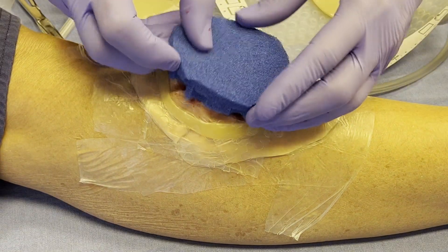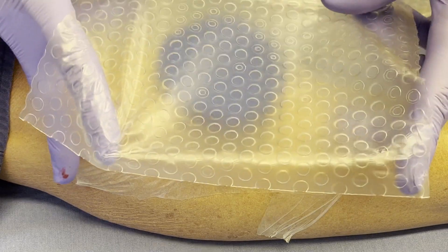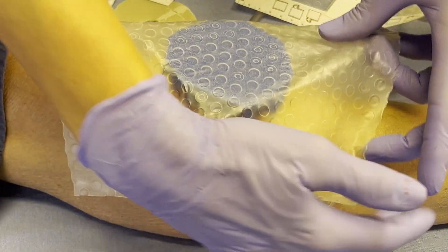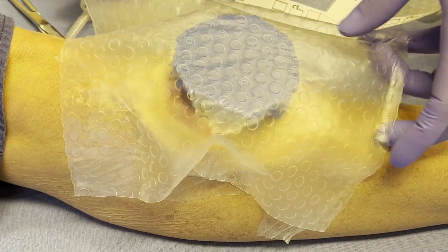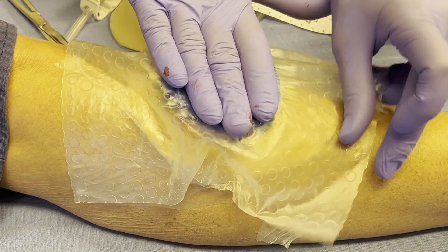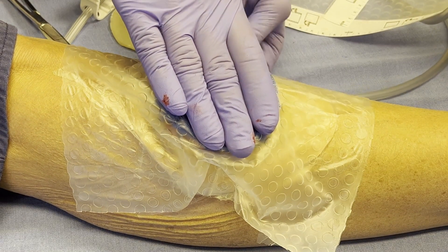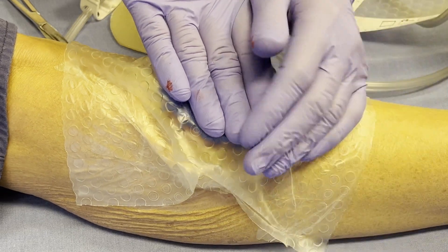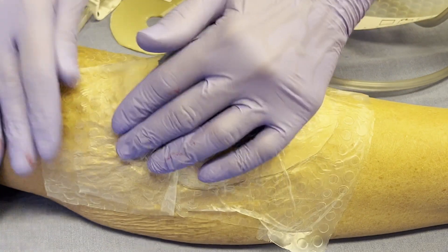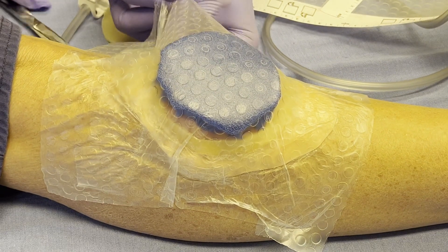I pre-cut my foam so I'm ready to go, and I'm going to take a nice big piece of Dermatec and cover this. I like to take the tabs off of my Dermatec before I put it on the patient. I lay it directly on top of the wound, and because you can reposition this drape — especially in a circular fashion like this leg — I put it right over the wound, compress the foam just a titch, and then lay these edges down. I can always go back and straighten them out, which is the beauty of this drape.